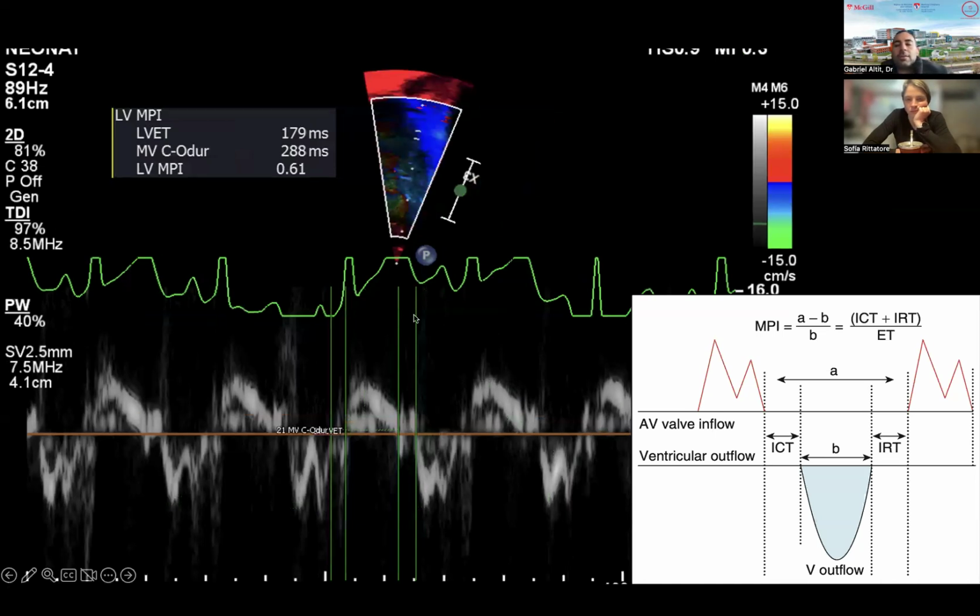And one of the components of cardiac function that we rarely compute at the bedside, but is more and more being used in some of the oncology literature for subtle dysfunction or to follow post-anthracycline administration, as well as in research format, is something called the myocardial performance index. It's also called the TEI index. What's the myocardial performance index? It incorporates the time you spend in isovolumetric contraction, the time you spend in isovolumetric relaxation, and the ejection time. So how do you measure that?